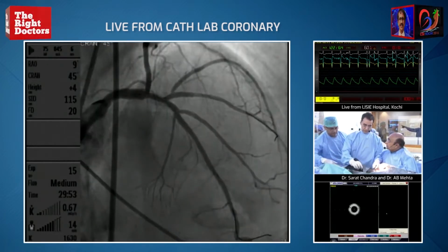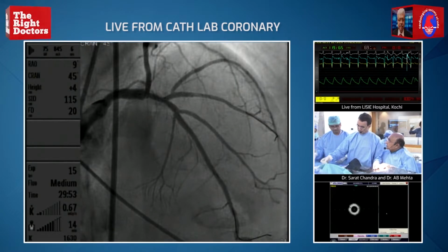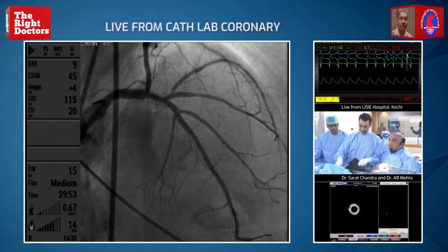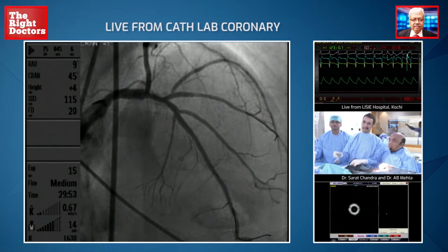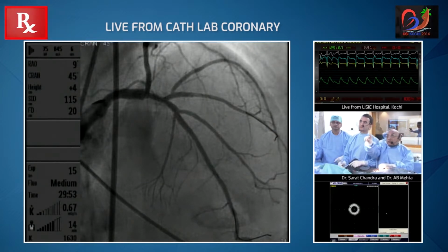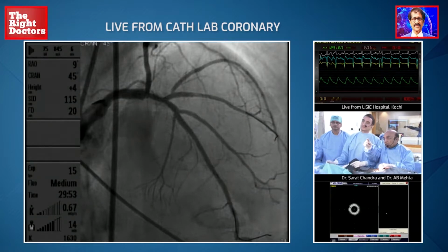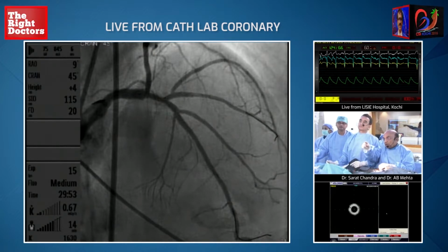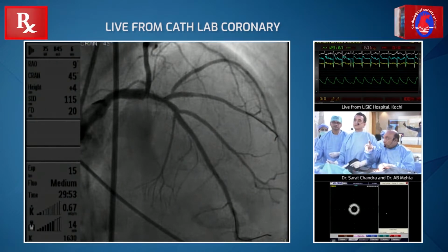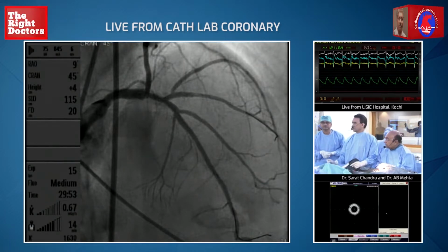What is he saying? Okay, you are suggesting a 3 stent, all right? Okay, 3 and then optimize it to a higher diameter proximally. So we will, Sharat, as we had thought, start from distal to bifurcation, come all the way down, crossing the septal and that other branch, the second diagonal, so that would be roughly about 24. Yeah, this is anyway 24 is required. Onyx 24, 26 fine.